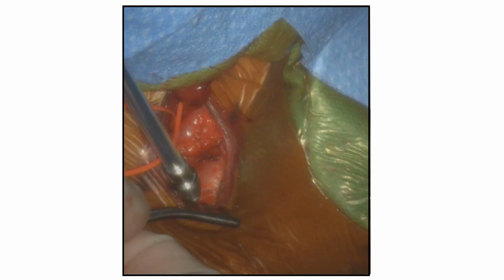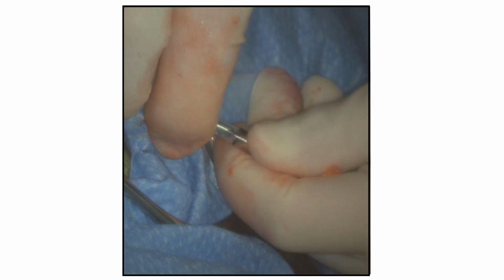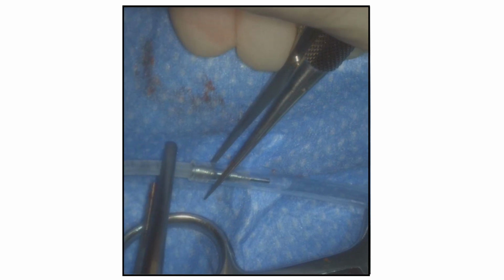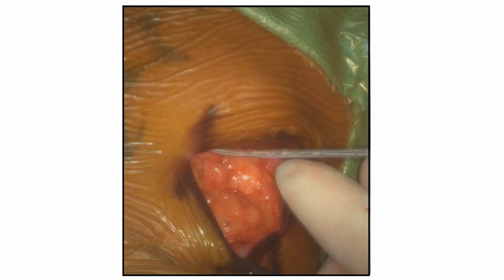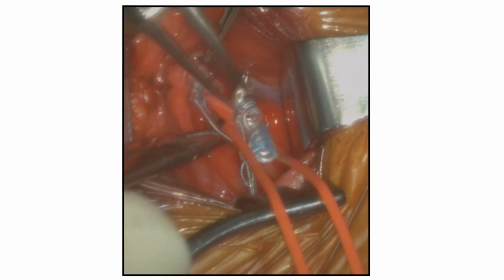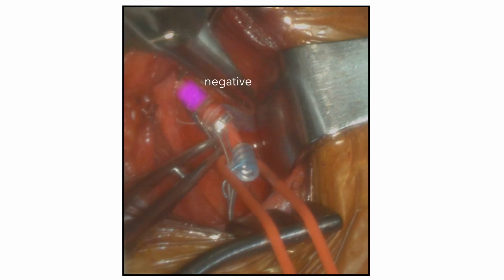Then a tunneler is used to connect the neck and chest incisions. A cable is run underneath the skin through the tunnel. With the help of a right angle, the electrodes are placed on the nerve in a stepwise fashion, starting cephalad and traveling caudally. First the negative electrode, then the positive electrode, and finally the anchor is secured.